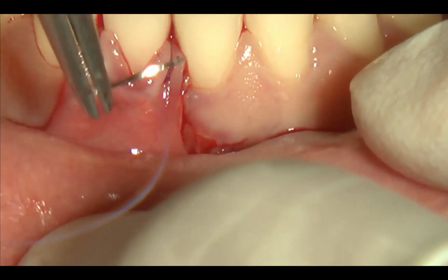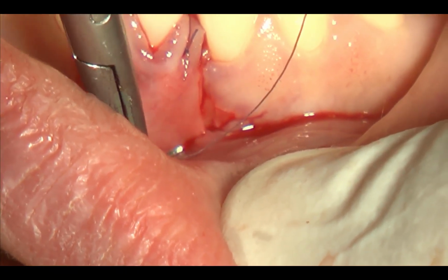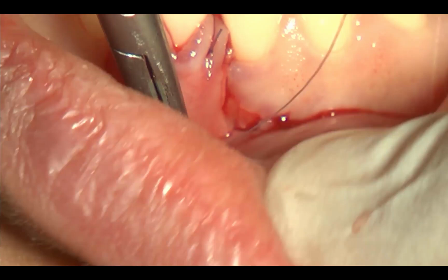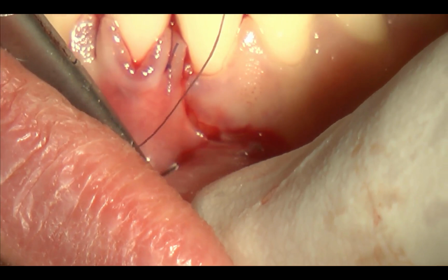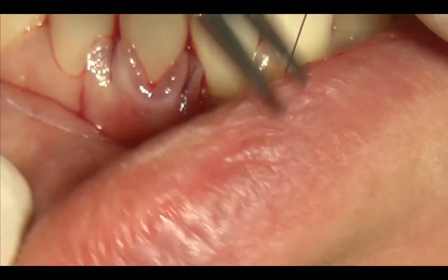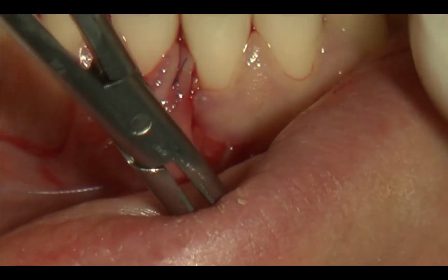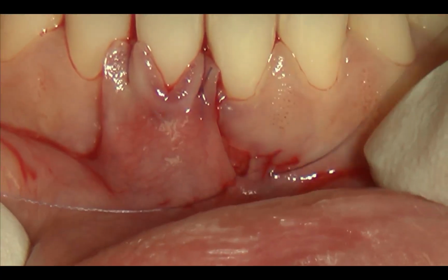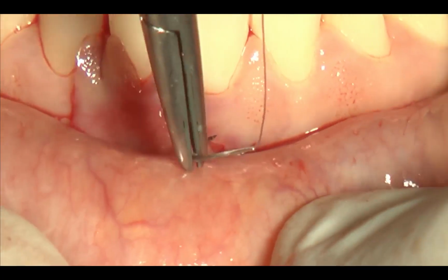Lascia così, così. The problem is that you have to see allora tieni solo così un attimo, così. Se vedi niente, tu prova a fargli vedere appena, non dovreste tirare giù verso il basso. Così si vede. Togli solo la tua testa che occupa la luce. Qui dall'alto così devi tirare. Sì. Aspetta un secondo.